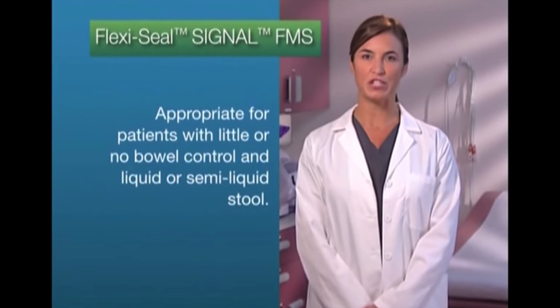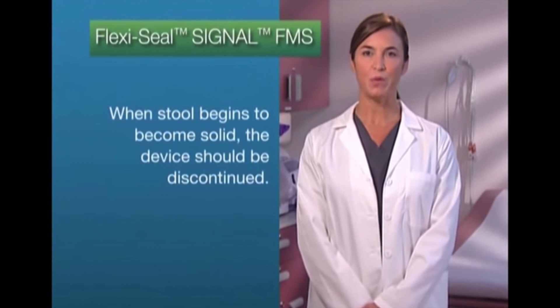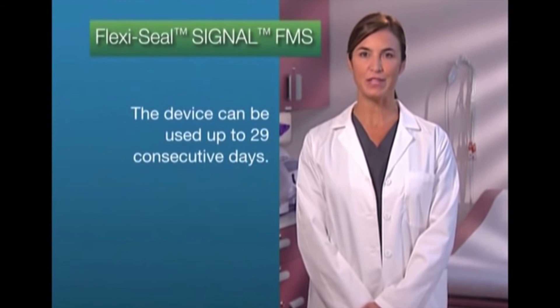Thank you for joining me for the introduction to the FlexiSeal Signal Fecal Management System. This system is appropriate for patients with little or no bowel control and liquid or semi-liquid stool. When the stool begins to become solid, the device should be discontinued. FlexiSeal Signal FMS can be used up to 29 consecutive days.